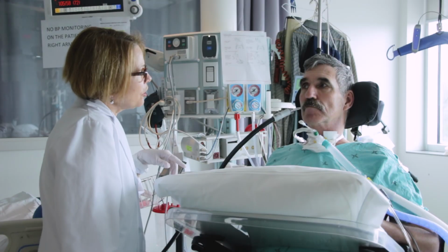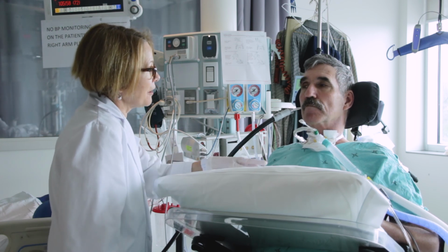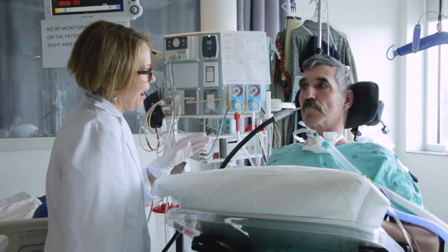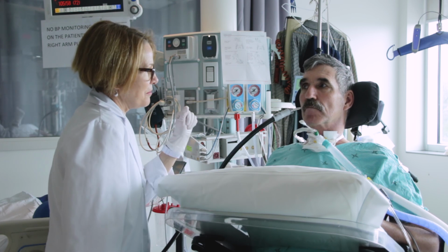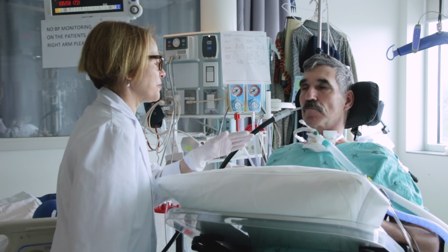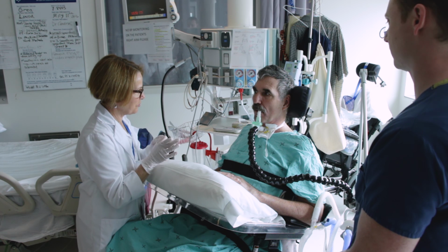It's difficult to do glossopharyngeal breathing with the ventilator giving you a breath through the mouthpiece at the moment. So we'll take a little break, and when Aaron comes back, we will discontinue the ventilator and set the mouthpiece at bedside or at your chair side. You'll be in control of when you need that supportive breath and how much. Okay, remove the mouthpiece.